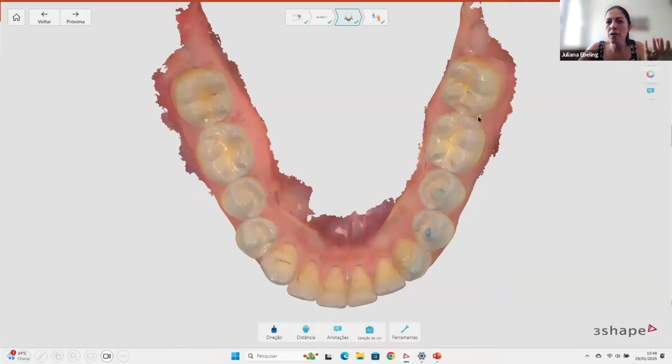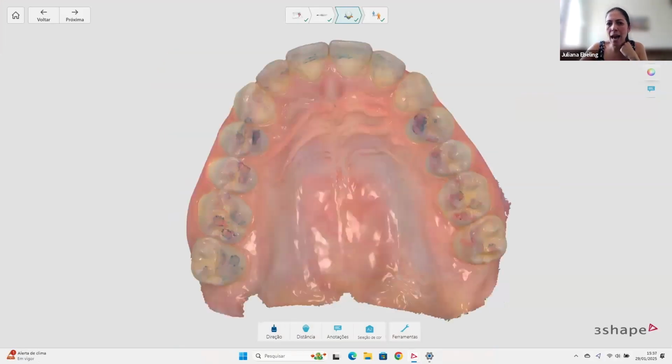And what I would expect from these teeth is a good occlusion, a good contact distribution between them. And what we really have, look here, is very large contacts. What is the complaint of this patient? Muscle pain, muscle discomfort. I'm always trying to relax.